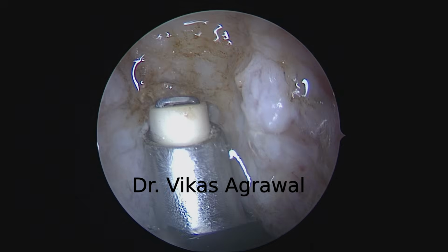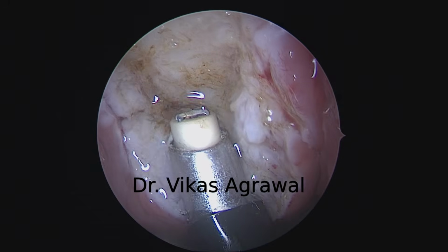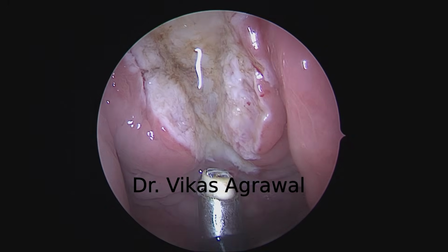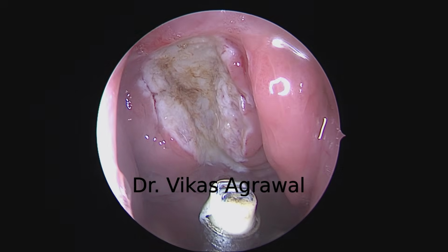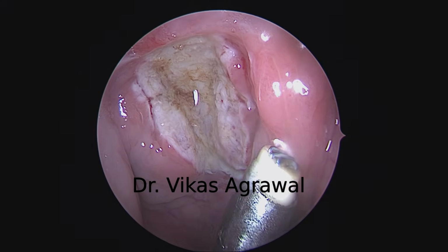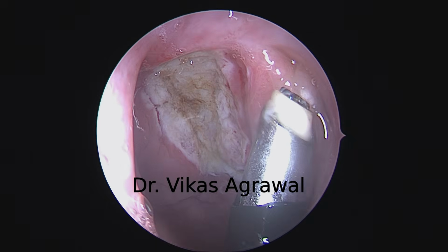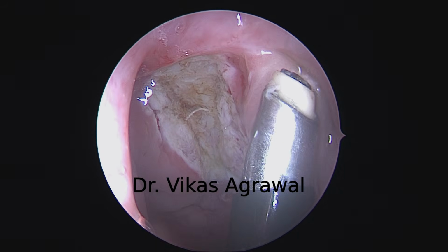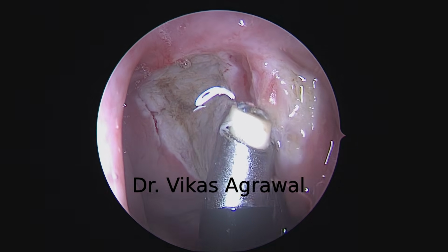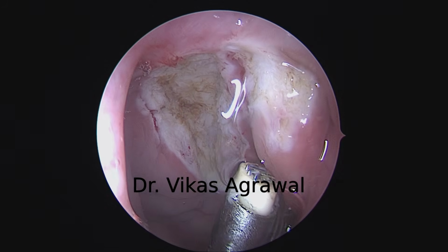Now that's the posterior boundary, buccopharyngeal fascia, defined almost everywhere. I'll go for my lateral boundary. The lateral boundary anteriorly is the torus tubarius, and there is some lymphoid tissue here. I am remaining 4 to 5 millimeter away from the eustachian tube and only removing the submucosal lymphoid tissue, which is the lateral boundary anteriorly.